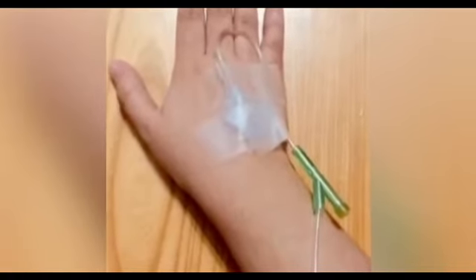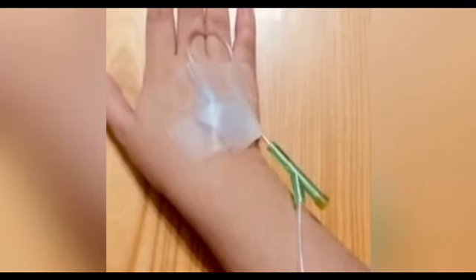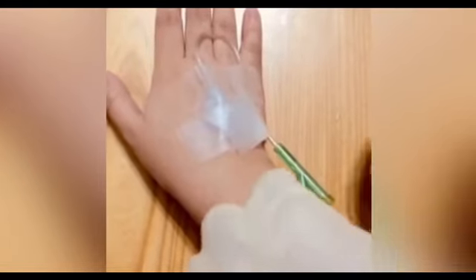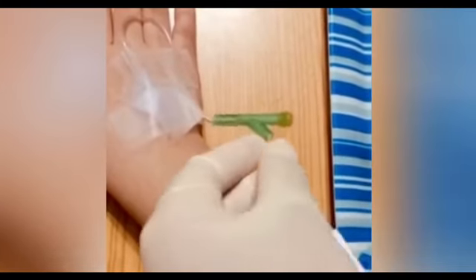Good morning. Today I will be demonstrating one of the applications of IV route administration, which is through IV bolus or IV push. So before administering, we need to disinfect the port of the IV line. Then we take our flushing solution to check for the patency of the line.